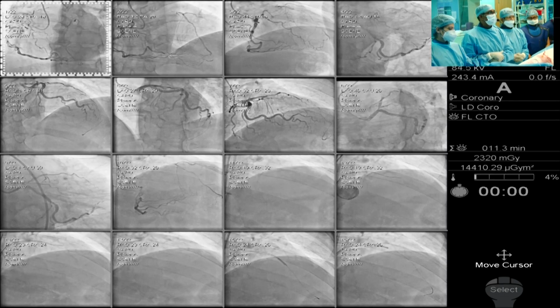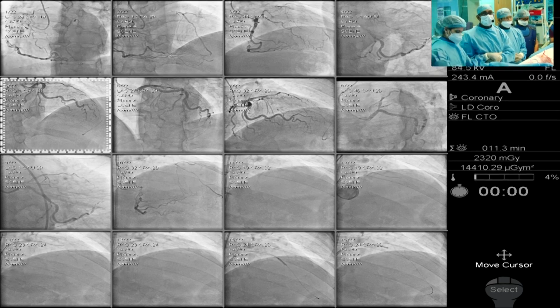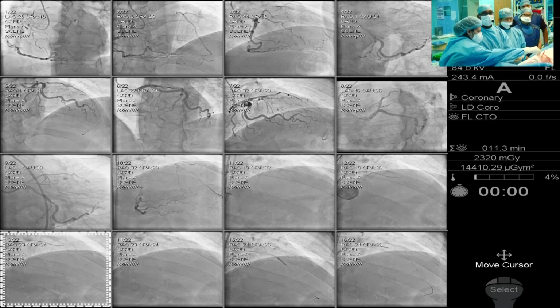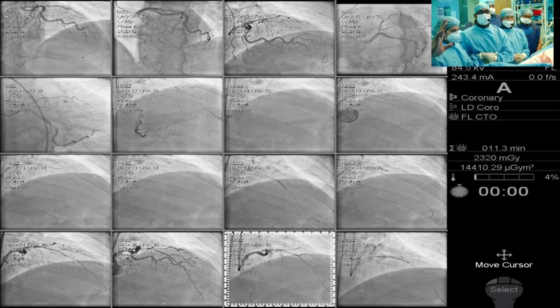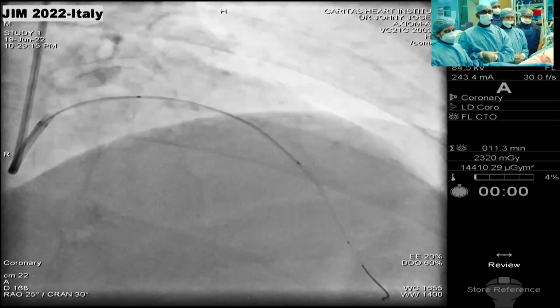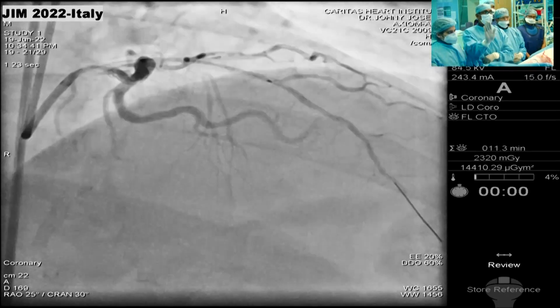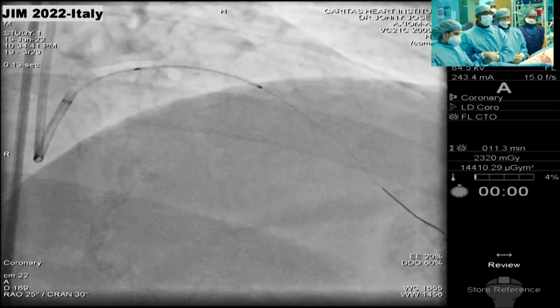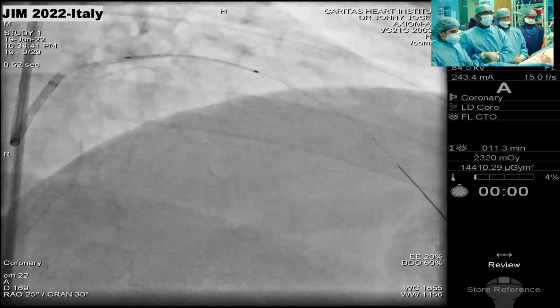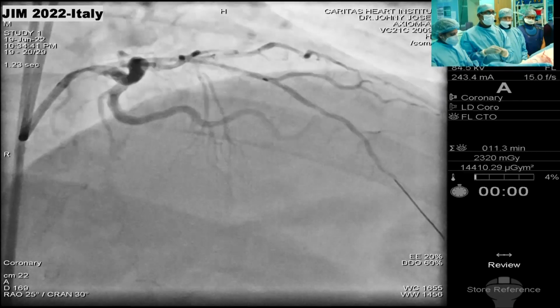If you apply the 3-5 rules here, you don't have any indication for lithotripsy or rotablator or anything of that sort. And I agree with the decision of avoiding this very diffuse distal disease, which in part is also due to under-dilatation of the distal lumen, because a vessel under-pressurized for years, being filled only by collaterals, will take time to regain its normal size.